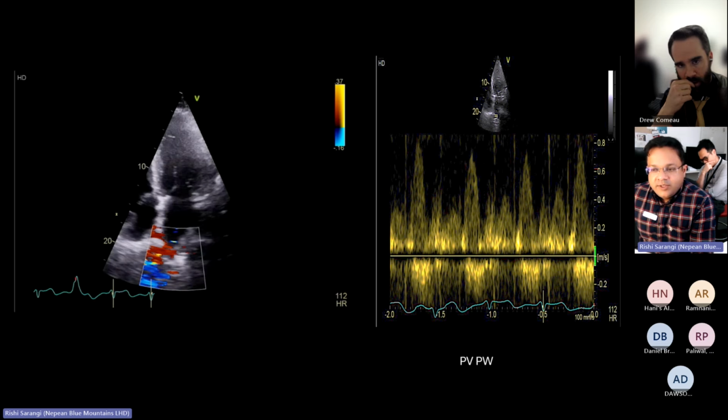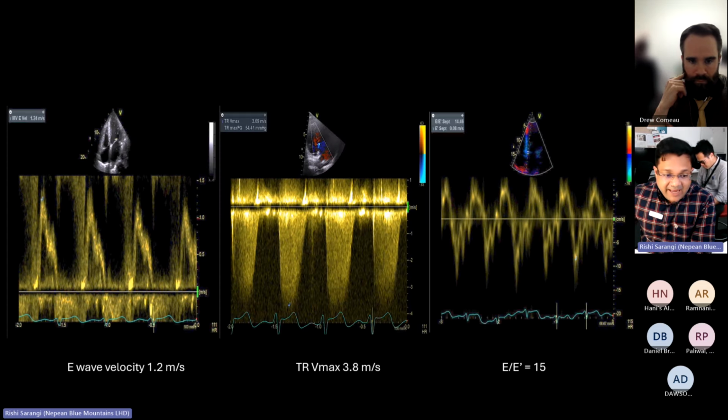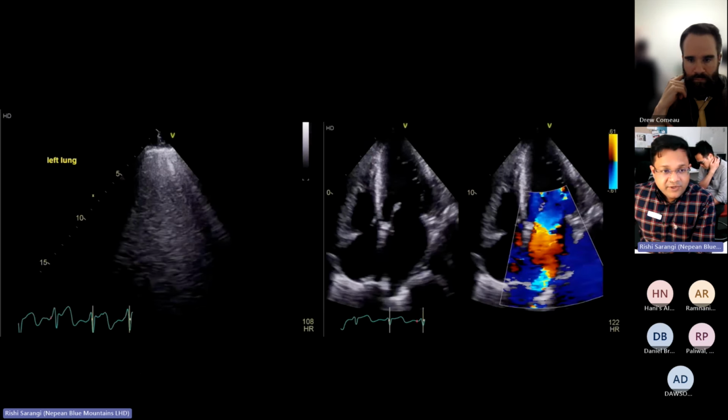So the reason for doing this case is just about quick pattern recognition, by doing a few things and seeing how we can connect the dots and advocate more towards whether the left atrial pressure, which is something clinically relevant to us, which is something we can treat, is elevated or not in this patient. So we have a mechanism. The patient is in pulmonary edema. There is a reason why there will be left atrial pressure elevation.